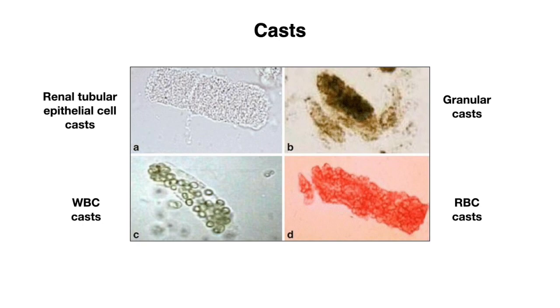Now that we've run through all the material, let's summarize what we've discussed. We discussed that with the urine analysis, there are 3 basic components: your gross inspection, and this is where we look at the color of the urine as well as the cloudiness of the urine, and it's not usually as useful as our other 2 tests.